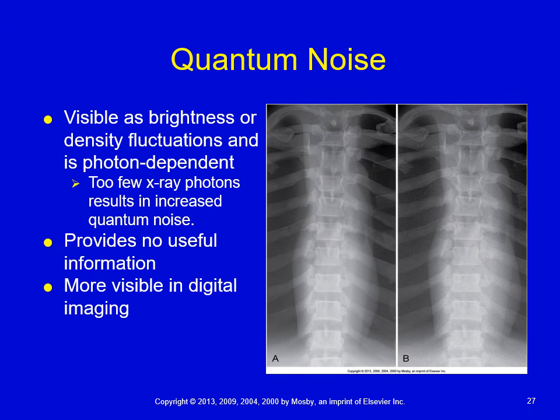They'll be able to interact with the patient, exit, and be able to be transmitted for the image, to make the image per se. All right, so again, image noise is not a good thing.